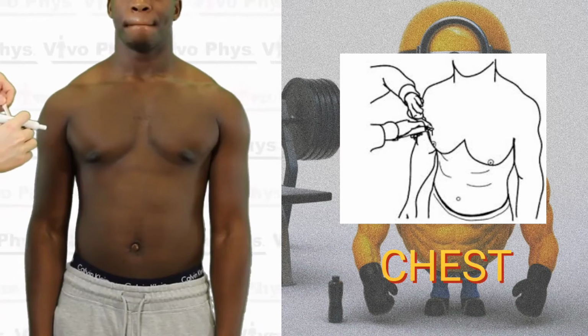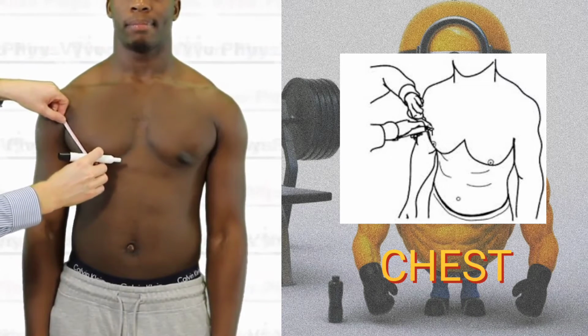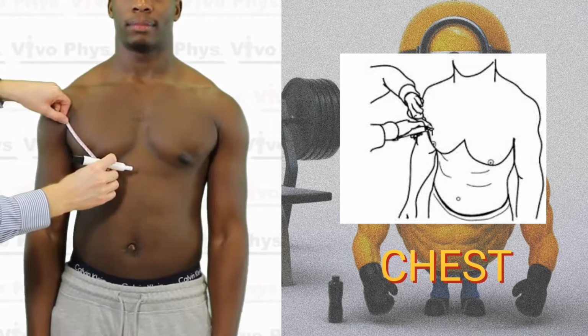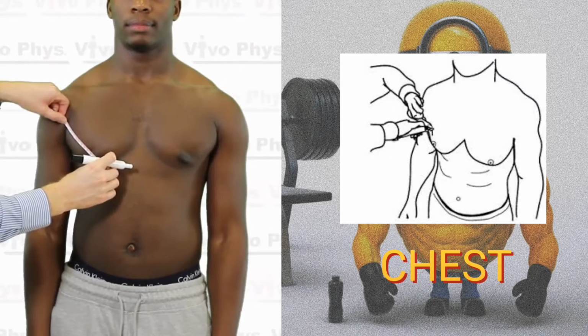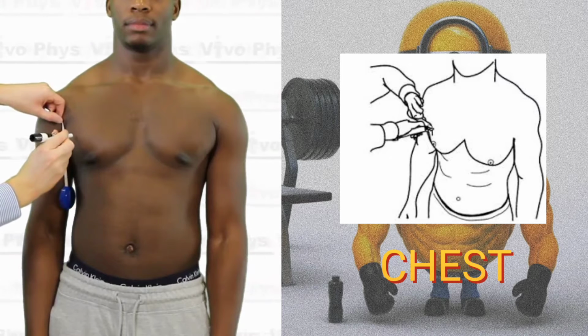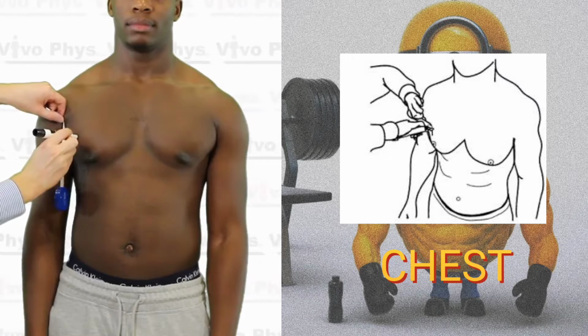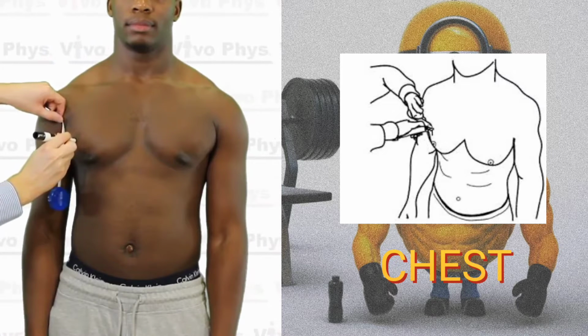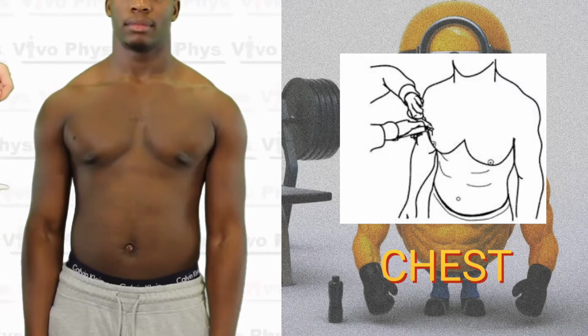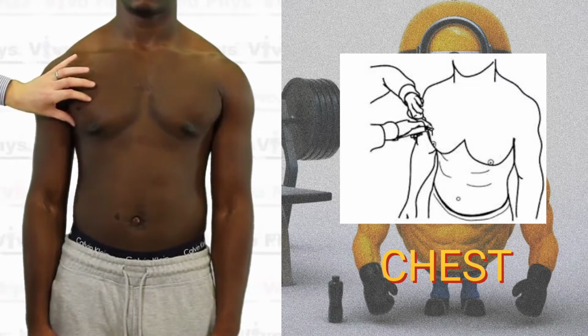The chest skinfold site is the only one that is different between males and females, and the difference is pretty small. All right, so what you're going to do is look for the armpit and the nipple of the individual. If you can't see the nipple, for instance, if a female is wearing a sports bra, you're going to estimate where that would be, and you can basically assume that it's in the center of the right side of the chest, at the bottom of the chest. Either way, again, you're going to look for the armpit and the nipple.